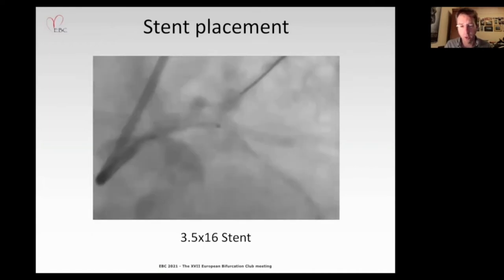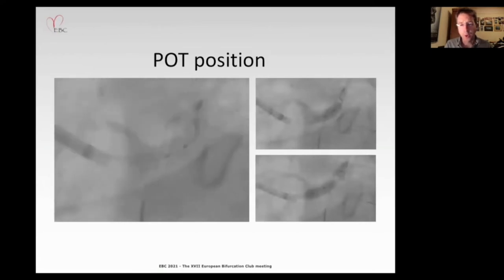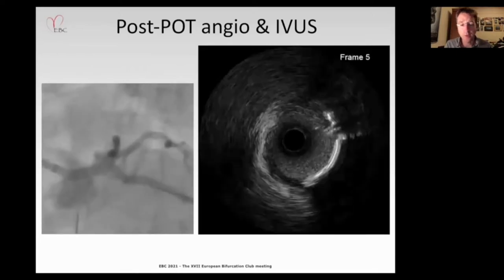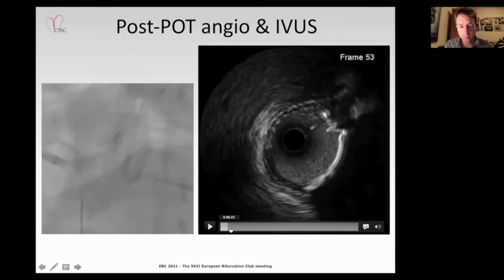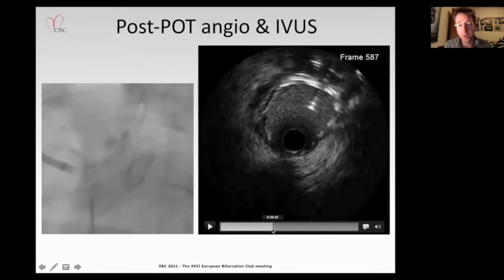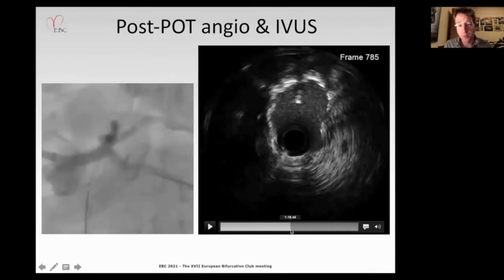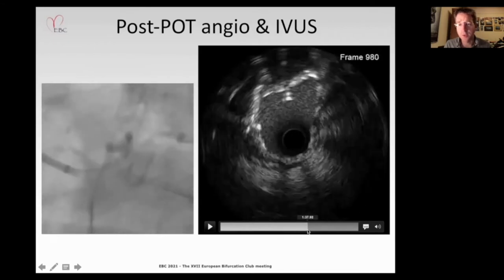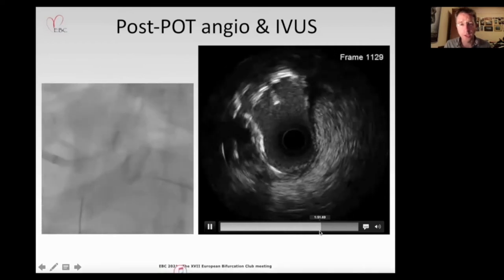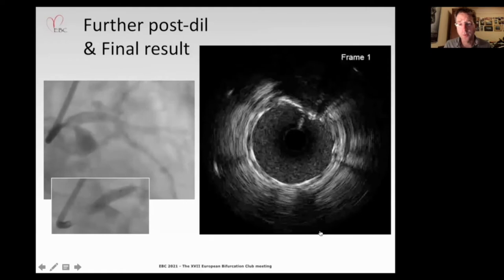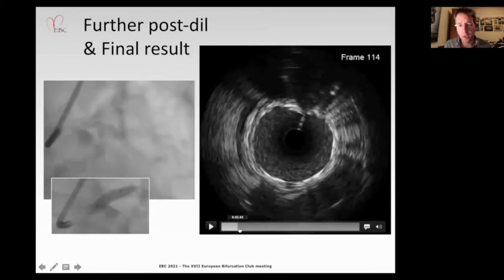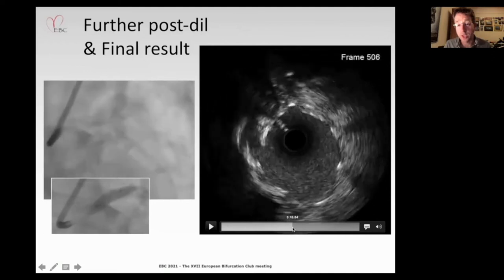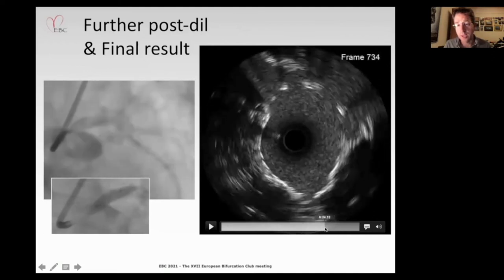A repeat IVUS confirms we have effectively modified the lesion. Importantly, relative sparing of the circumflex ostium supports the potential for a provisional approach. The before-and-after IVUS comparison demonstrates quite effective modification prior to stent implantation. A 3.5 by 16mm stent is selected based on IVUS measurements. We place a 4mm balloon distally and extend back to the ostium. The angiogram looks effective, but IVUS subsequently shows still some under-expansion in the body of the left main — confirming the importance of IVUS-guided optimization.